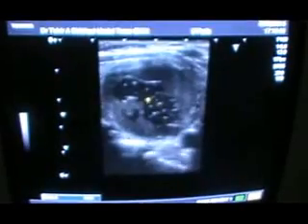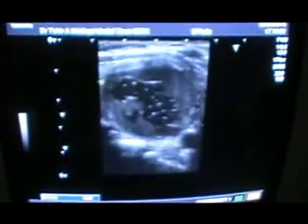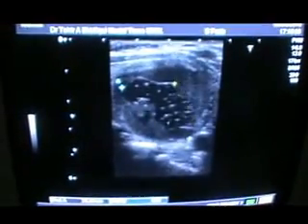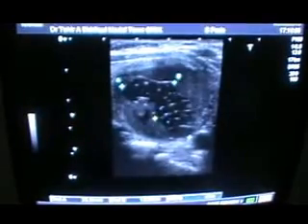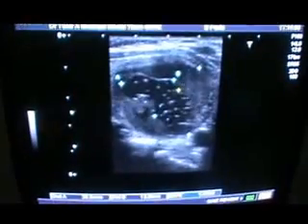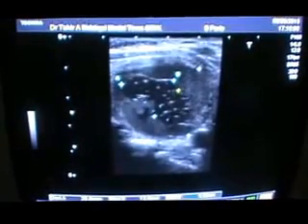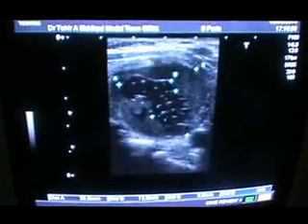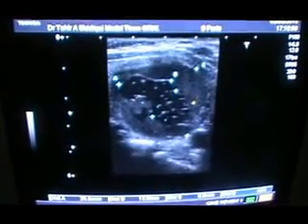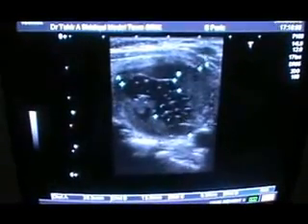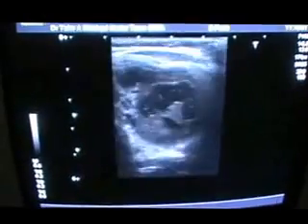These are tiny and complete thin septals. These findings are suggestive of cholesterol calculi. This is the fluid part, in which are suspended multiple tiny echoes, and this is the thick echogenic rim, irregular, surrounding the central cystic area. It is relatively hypoechoic, but for the cyst, it is an echogenic area around the cystic mass we are seeing.